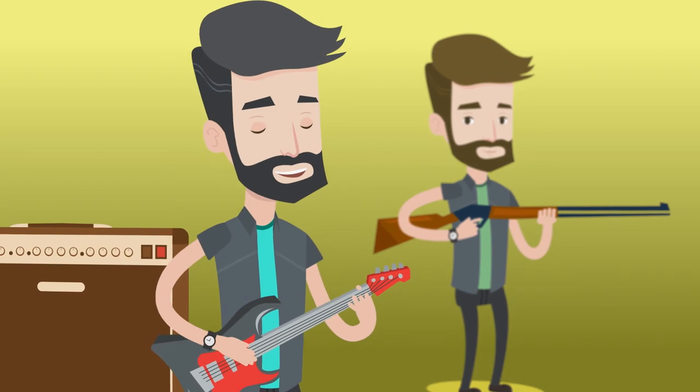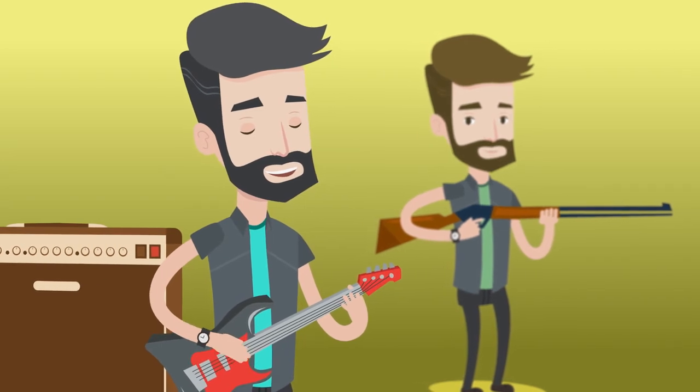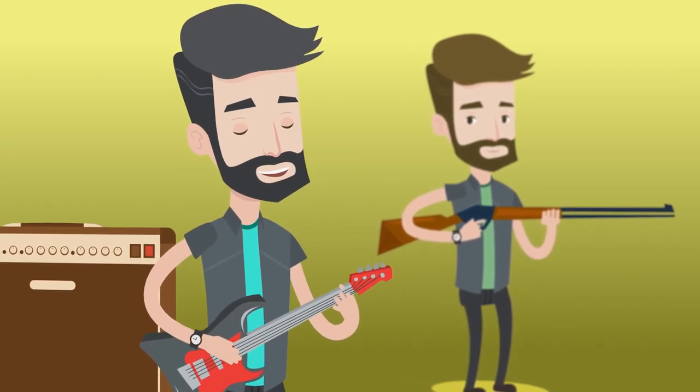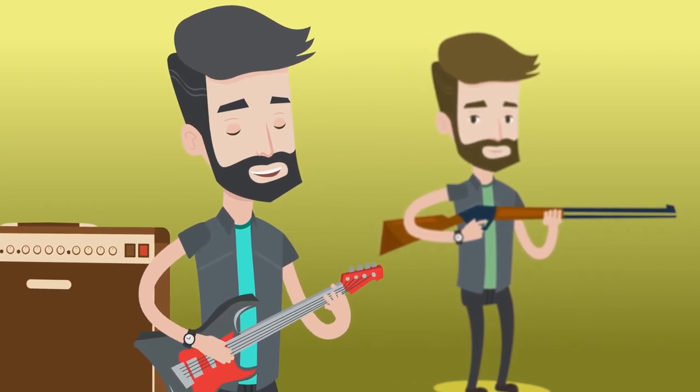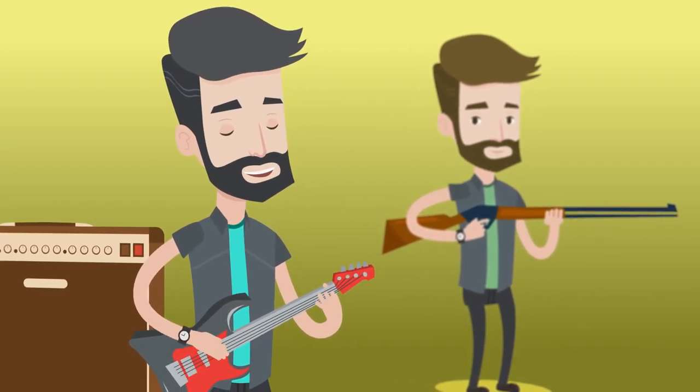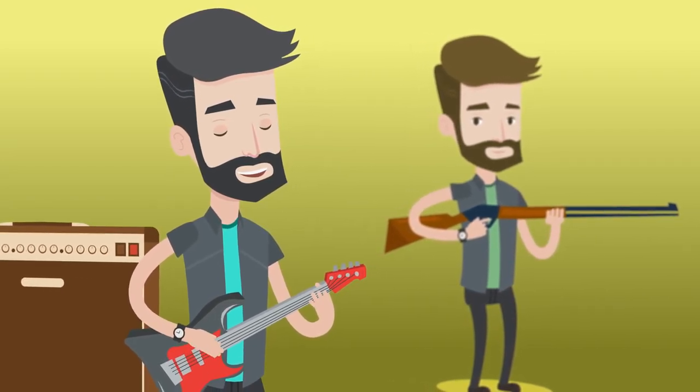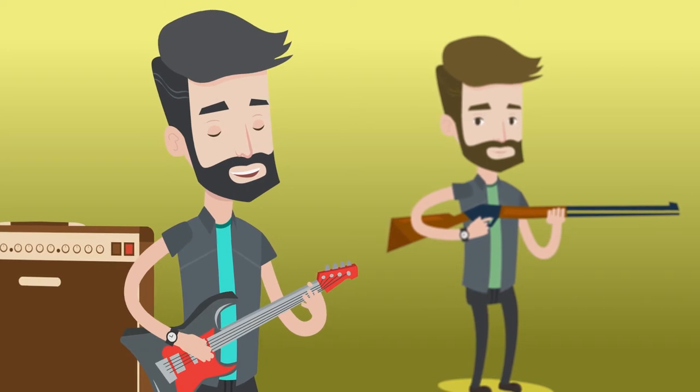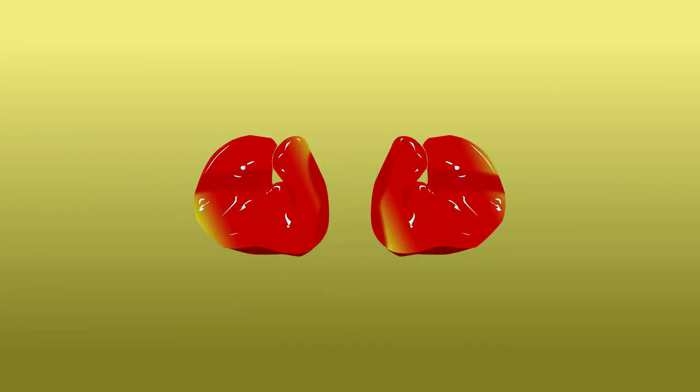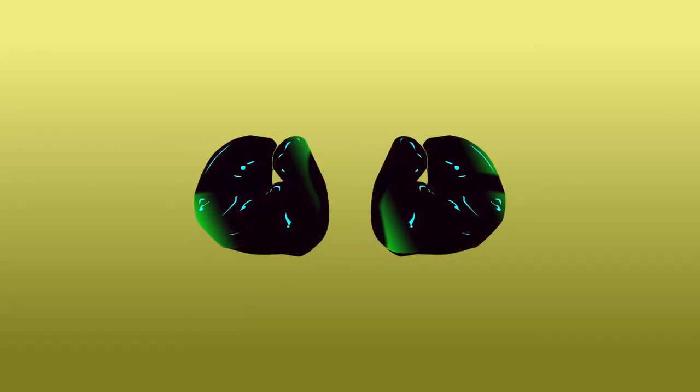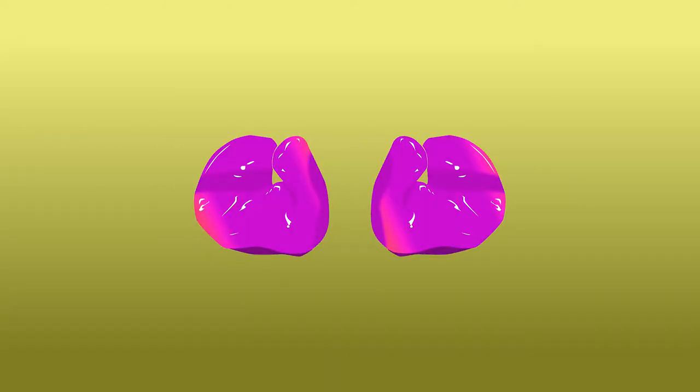These allow that individual to continue doing what they love without the fear of losing hearing due to noise exposure. They also can be customized with fun colors or different designs.